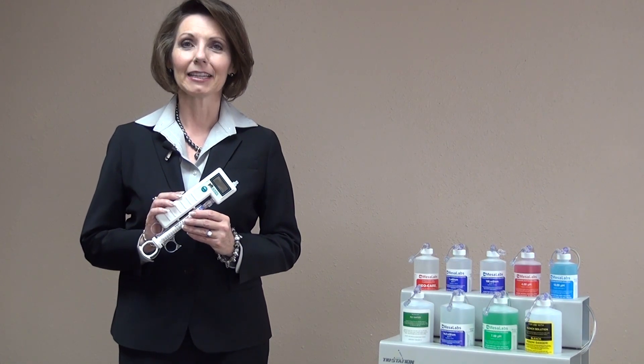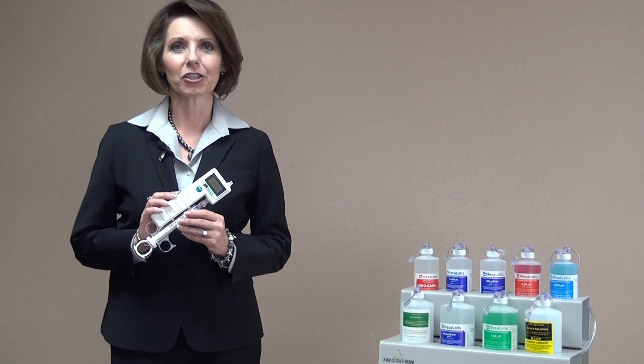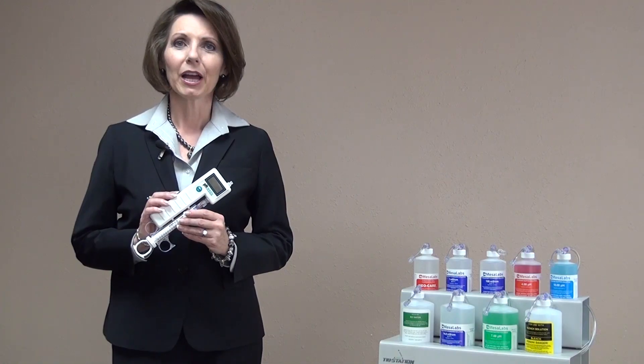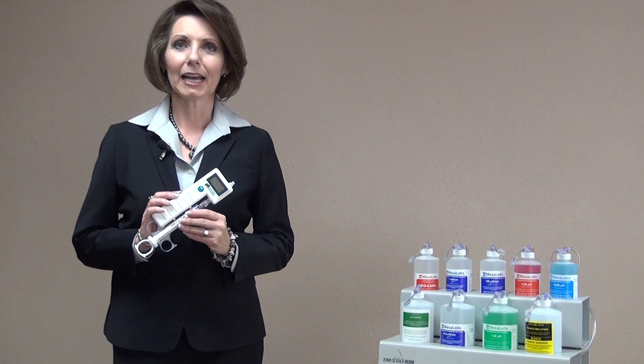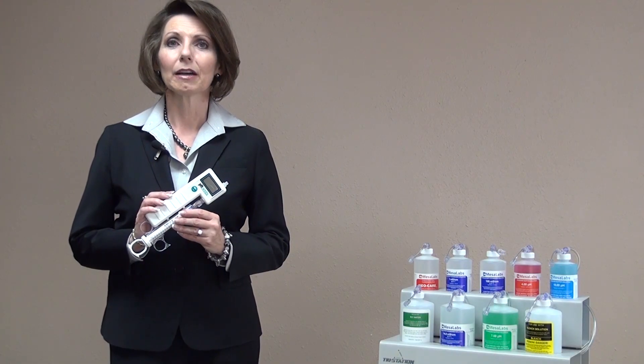In this video, I will demonstrate the Phoenix Meter Level 1 and Level 2 calibration. In order to perform the Level 2 calibration, you must first be in the Level 1 calibration mode. Therefore, I will first demonstrate the Level 1 calibration mode, and then go directly from that without exiting to the Level 2 calibration.